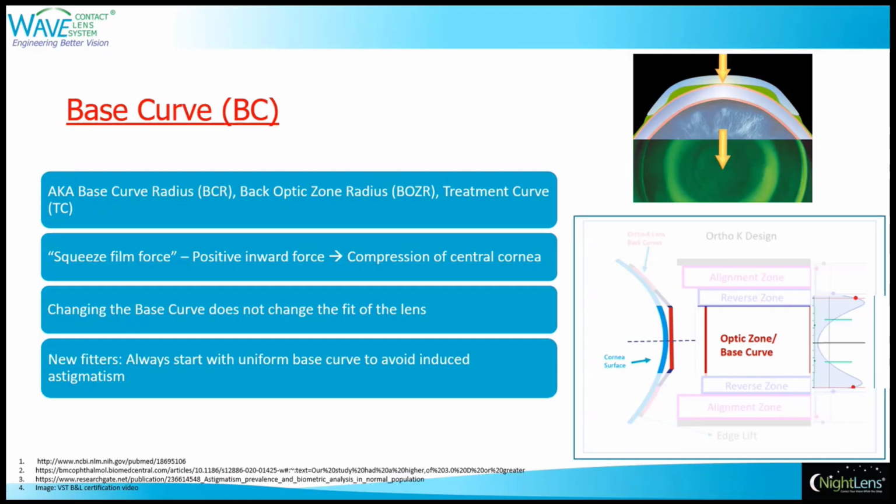Base curve. The next parameter we are going to talk about is the base curve. The base curve has a few names that you might be familiar with: the base curve radius, back optic zone radius, or the treatment curve.